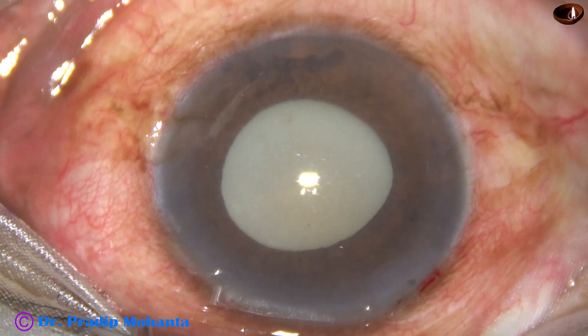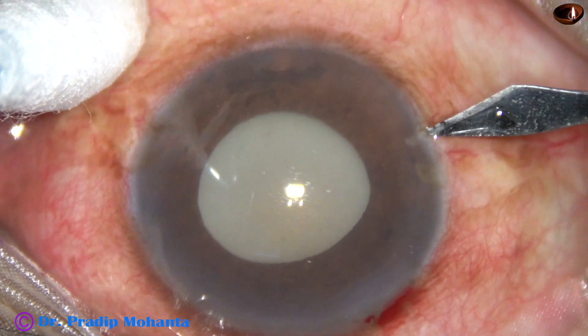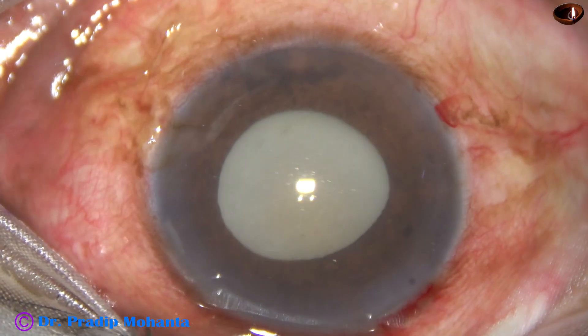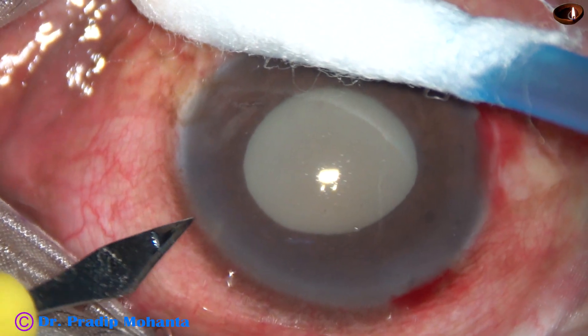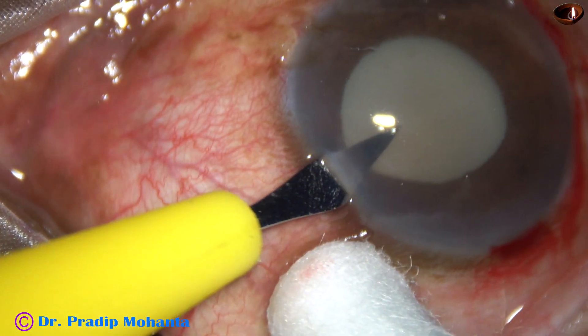This is a side port about 3 o'clock hours away from the main incision on the right side. And this is another side port on the left side, about the same distance away — 3 o'clock hours.